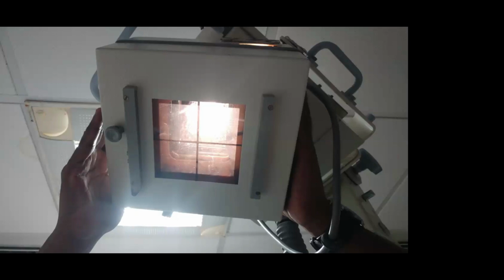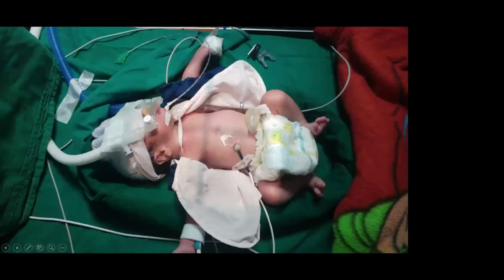If you are not so sure how to do it, or if you are relying a lot of the time on just a technician and the on-duty nursing staff who may not know how to exactly match the angles. So when you turn on the beam, this is the kind of lines you will see.